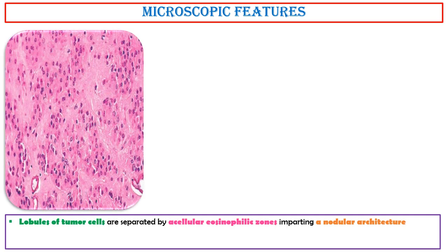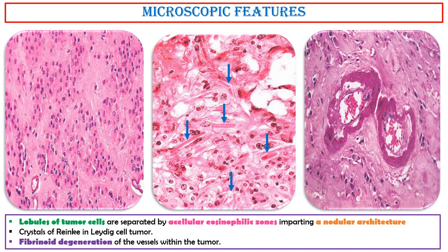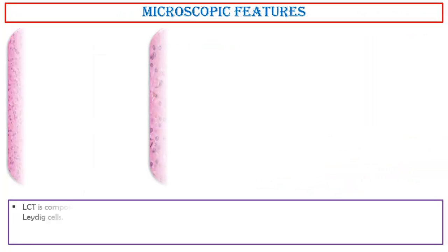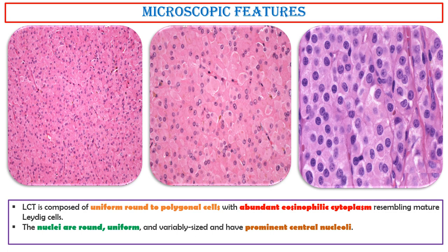Microscopic features. Lobules of tumor cells are separated by acellular eosinophilic zones, imparting a nodular architecture. Crystals of Reinke in Leydig cell tumor can be seen in this photo. Fibrinoid degeneration of the vessels within the tumor can be seen. Leydig cell tumor is composed of uniform round to polygonal cells with abundant eosinophilic cytoplasm, resembling mature Leydig cells. The nuclei are round, uniform, and variably sized, and have prominent central nucleoli.